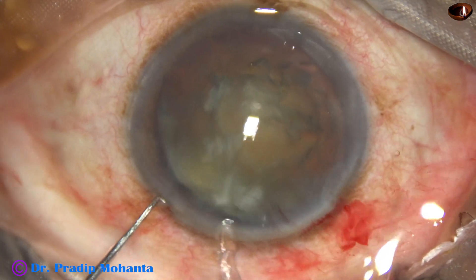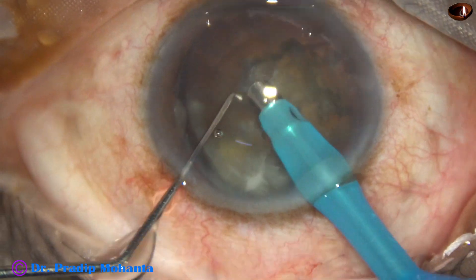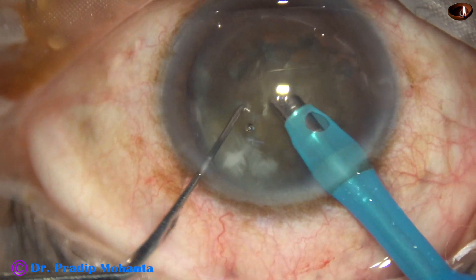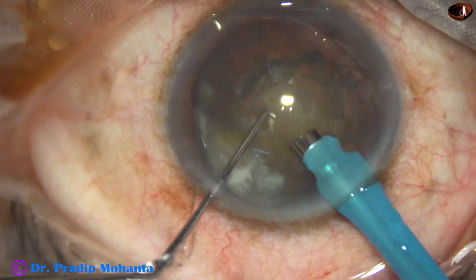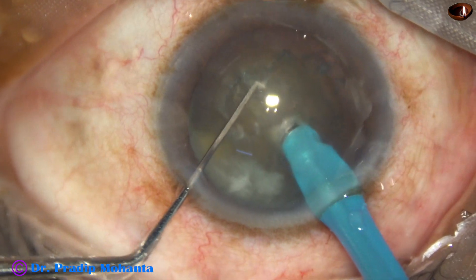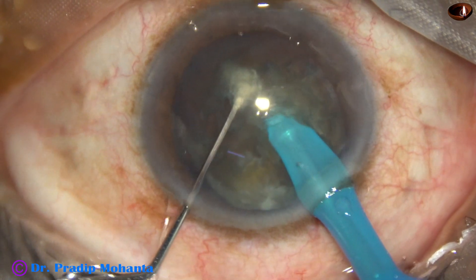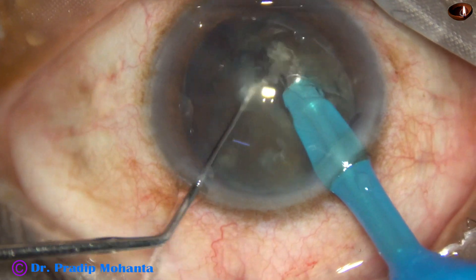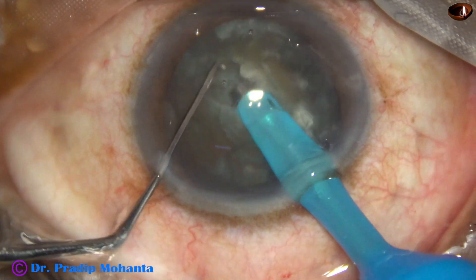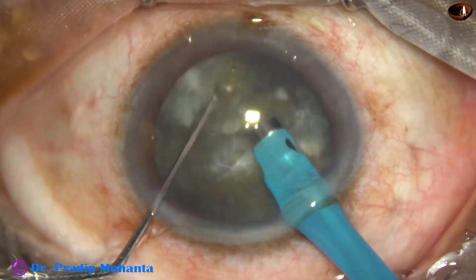We are going to do direct chop. Some superficial cortical lens matter is removed. Now the handpiece is turned to make the bevel up, the nucleus is pushed a little down, and the tip is buried into the substance of the nucleus, going through the nucleus towards the opposite equator. As it reaches near the opposite equator, the nucleus is separated.